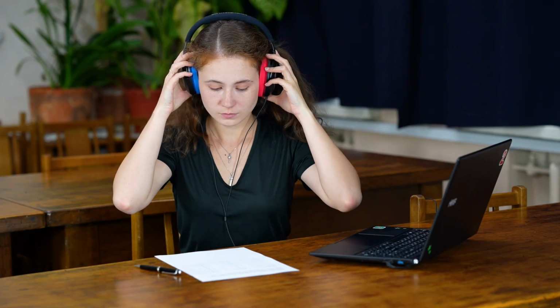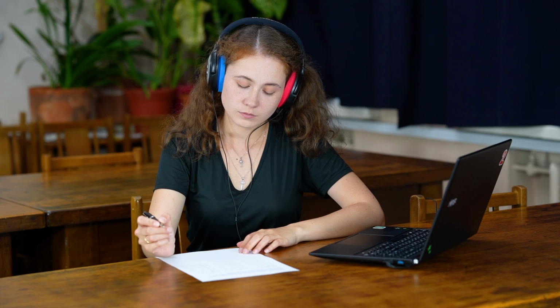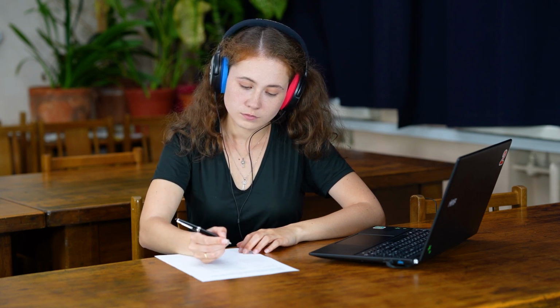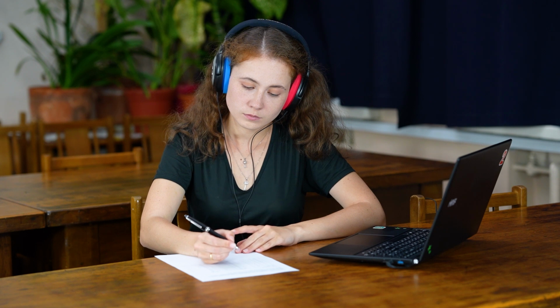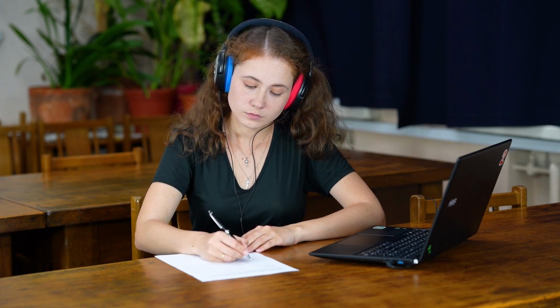After our participant has signed the consent form, we will offer her to take a modified Seashore test, which allows us to assess discriminative sensitivity to sound signals. In this test, we will present the sound stimuli in pairs through headphones. They would be the same that we will use to register mismatch negativity. For each pair of sounds, the participant must determine which of the sounds is higher and indicate this on the answer sheet.